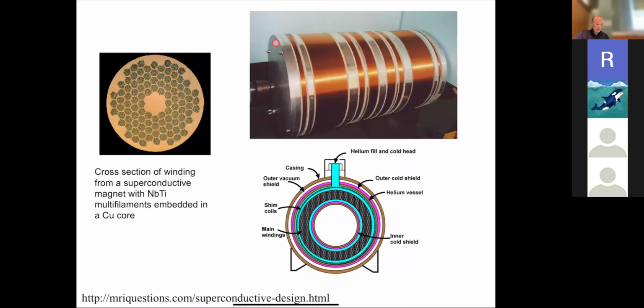So this is the magnet coil. Basically every wire is made of superconducting material. The most traditional design for magnets now is you have a lot of windings, typically a solenoidal winding of this superconducting wire. That's the wire shown here. These are what's called the main windings. And the magenta stuff, I guess, is the helium in this case.